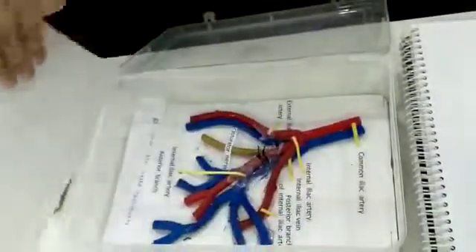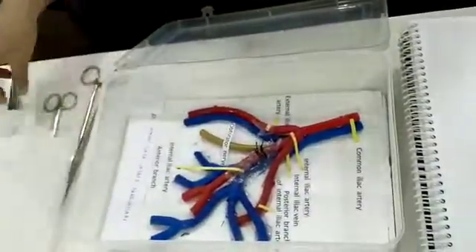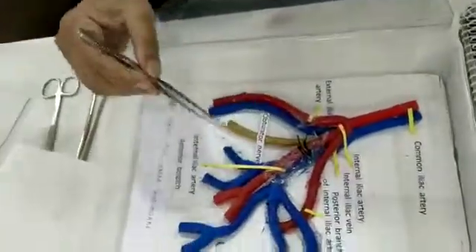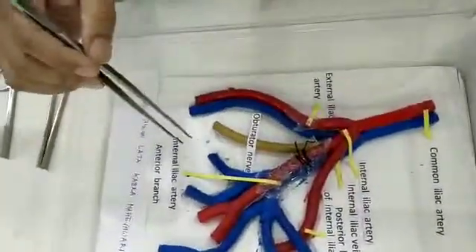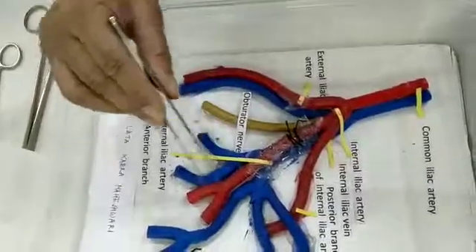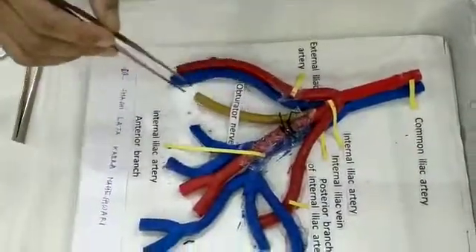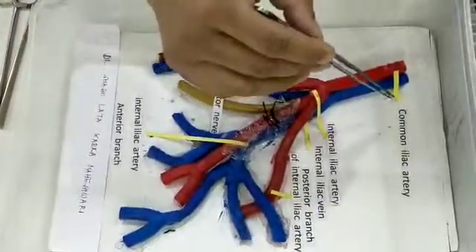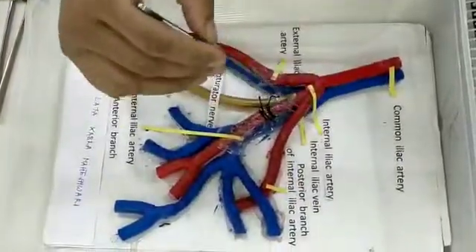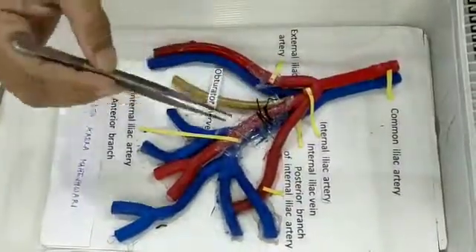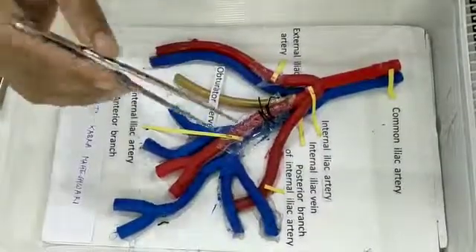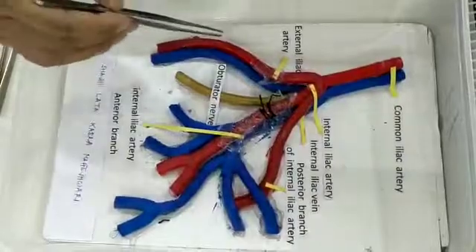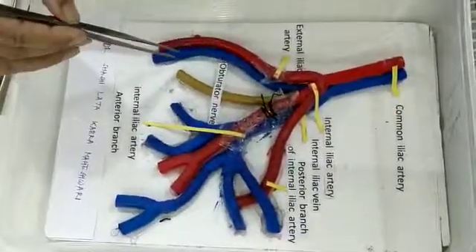I have used plastic tubes which are sprayed with color to represent different types of arteries. These are the veins in blue color, and this is the obturator nerve. This is the common iliac artery, internal iliac artery below, internal iliac vein, posterior division of internal iliac artery, obturator nerve, external iliac artery, and external iliac vein.